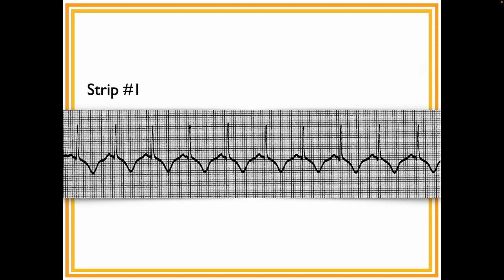Okay, even if you're not quite done, we'll discuss it as we go. So Ann, what'd you get for strip 1? I think that's pretty darn regular. Okay, and let me ask you something, because it's a significant question. When you say pretty darn regular, there's a couple that are a tiny bit longer, but would people still say it's regular? Okay, and you don't have to remeasure it now, but do you remember how many small boxes it was irregular by? I think it was like less than one.